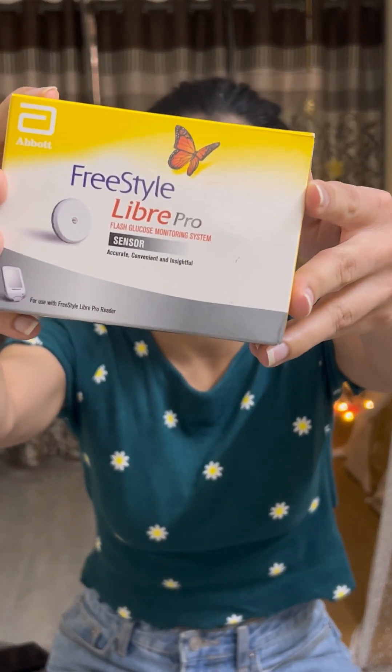Hi to all the T1Ds out there. This video is specially for those who are planning to use a sensor for the first time. I have got this LibrePro sensor, so I'll quickly take you through the contents of the box and how to use this sensor.